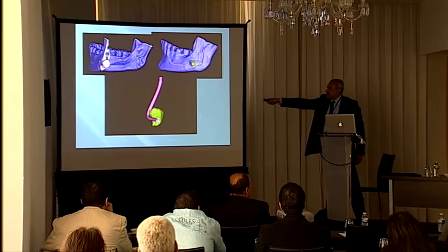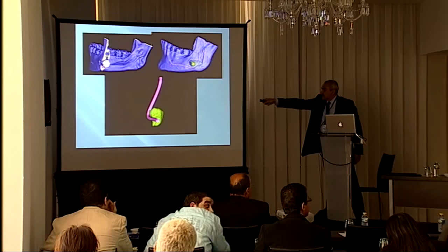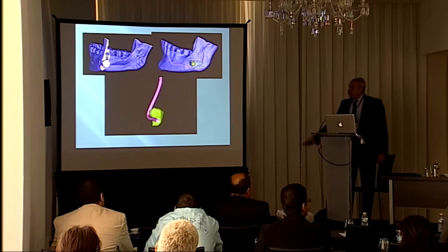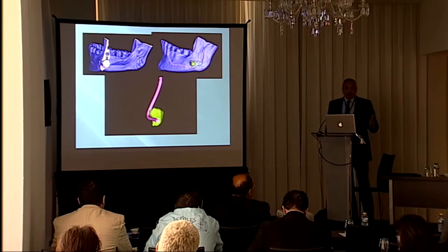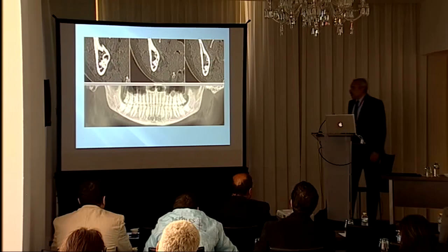This is a cut section. We can see the tooth. We can see the space for the cystic lesion, and we can see the inferior alveolar nerve, and we can take everything out and check the relation of the tooth and nerve alone to decide where to go, from where to reach and access the tooth, and where to put your tooth sectioning.